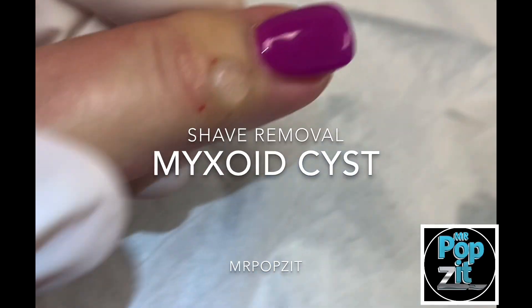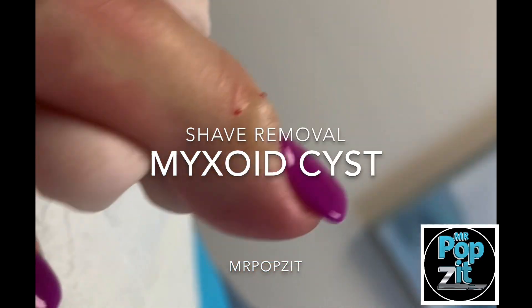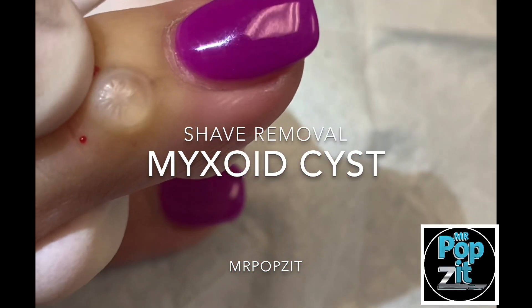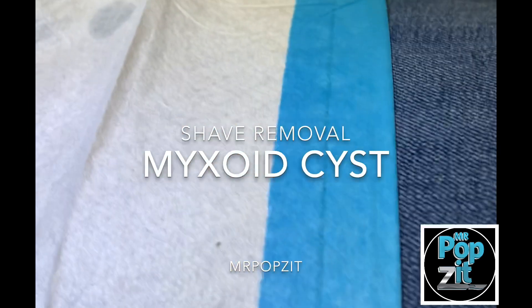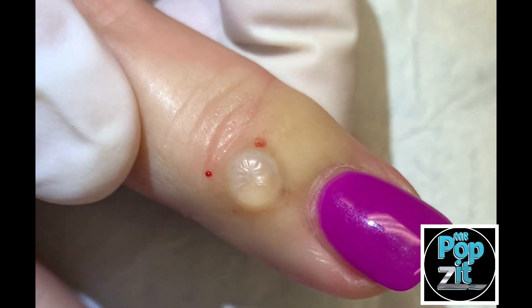Hi guys, Greg Lindstrom PA here. So we have a myxoid cyst. You can see this from the side. This is a gel that you'll see in here that comes out from the joint. You can see people can get them anywhere on the hand. Sometimes it's from trauma, sometimes it's from a little arthritis that's in there, and we have her numbed up here.